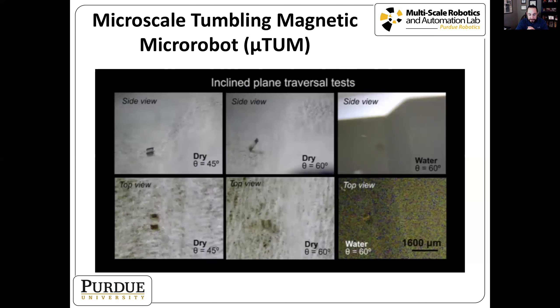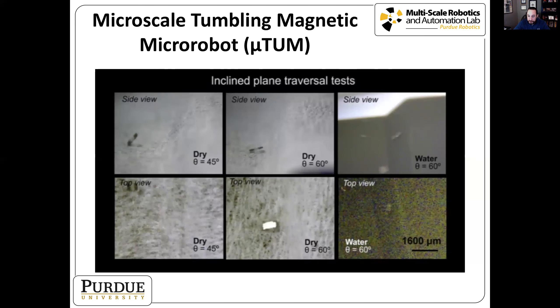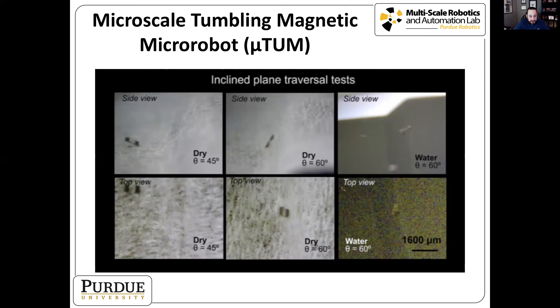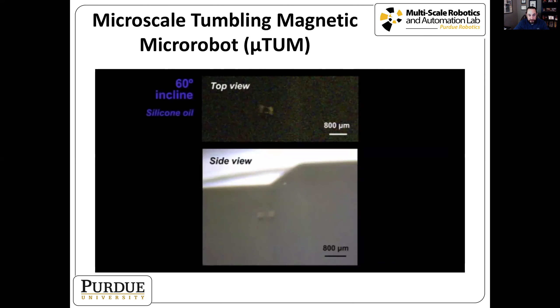We also looked at the robot's ability to climb inclines: 45 degrees in a dry environment, 60 degrees in dry, and 60 degrees with water. It handles 45 degrees fine in dry environments, has some difficulty with 60 degrees dry, but adding a little fluid reduces friction enough that it climbs a 60 degree incline very well. You can see a close-up of how the robot grips the surface and climbs this very steep incline.